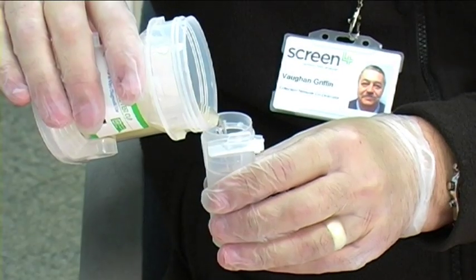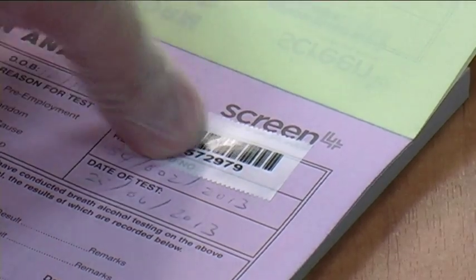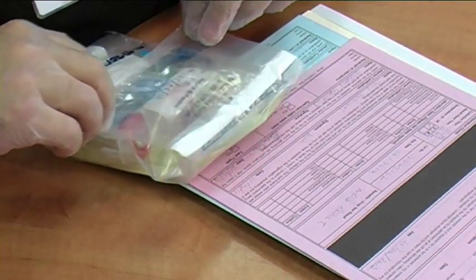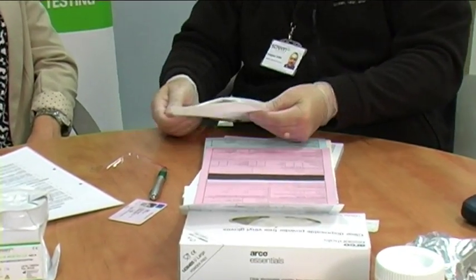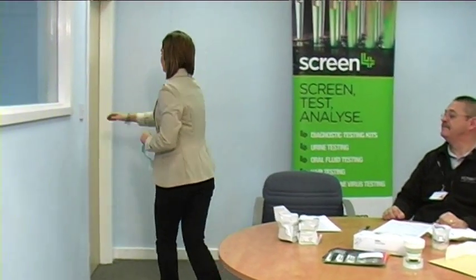However, if a line does not appear adjacent to a drug group after 5 minutes, it's classed as a non-negative screen, which requires further analysis via expert laboratory methods. The collection technician will advise of this, and the remaining urine in the main body of the cup will be packaged under chain of custody conditions in the donor's presence and shipped to the laboratory for expert analysis. All results will be reported back to your company.